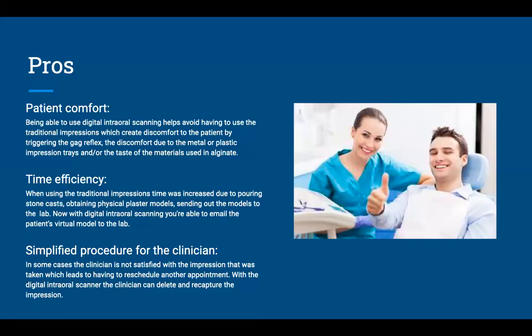In addition to that, it's more time efficient. With traditional impressions, you have to pour the stone cast, obtain the plaster model, and then send the models out to the dental laboratory, and that would take probably a week or two. So that can be a bit time consuming.